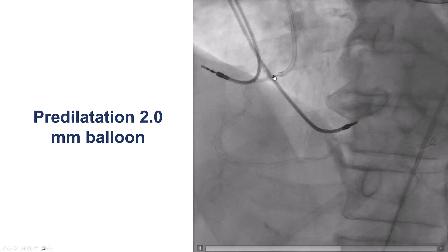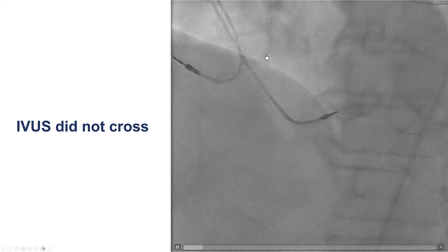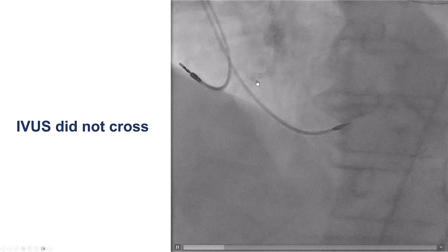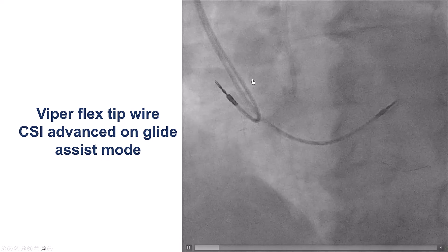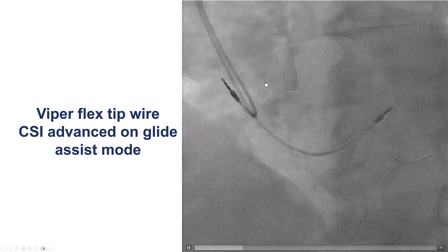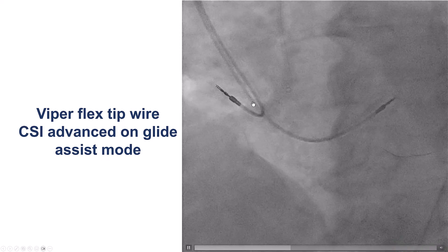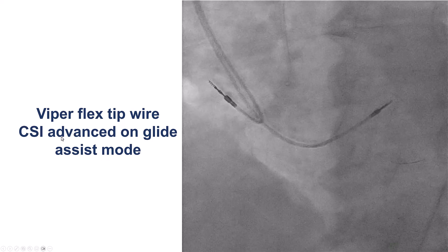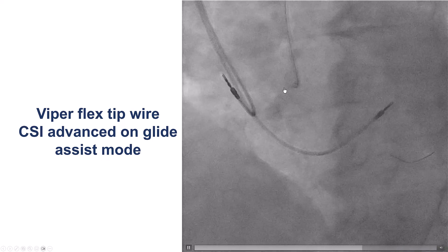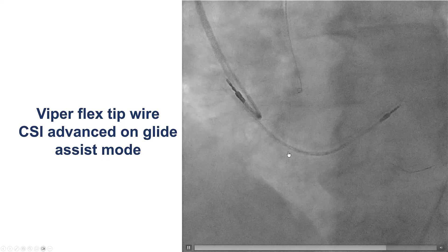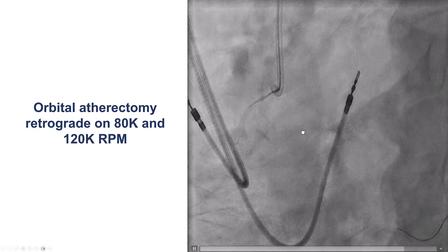After doing that, we pre-dilated with a small balloon, but couldn't deliver an IVUS catheter because of the ostial disease with calcification. So we decided to use atherectomy. We advanced the microcatheter again and exchanged the wiggle wire for a ViperWire Advance tip guide wire, with the goal of performing atherectomy. This is also a fairly supportive wire.